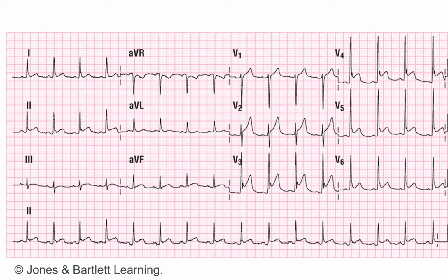Going to V1, is it wide or narrow? We all go with V1 being narrow? No bundle branch, cool. Looking at I and aVL, we have elevation, depression, or neutral? Look across, I hear you, but look across. Don't just look at the first beat, look across the whole lead. The isoelectric line is wandering, we have a bad baseline, could be due to some artifact. Somebody's not holding still, I don't know. Mad at the patient. Neutral, aVL's neutral, cool.